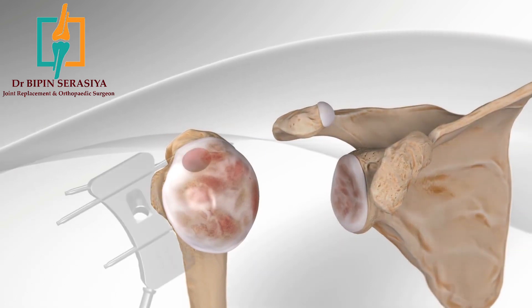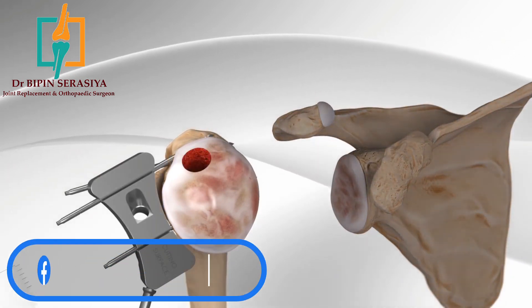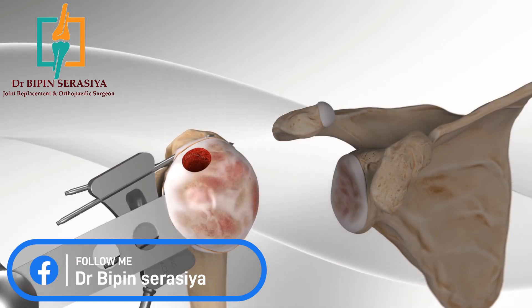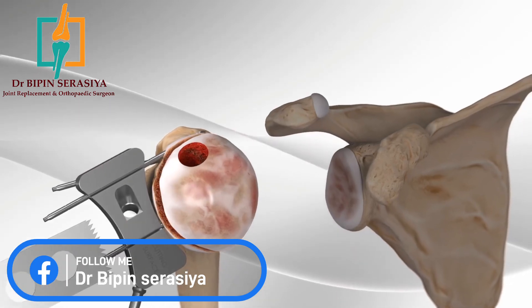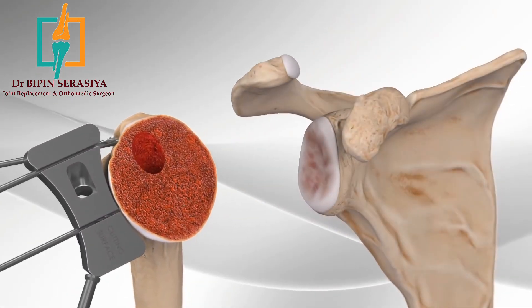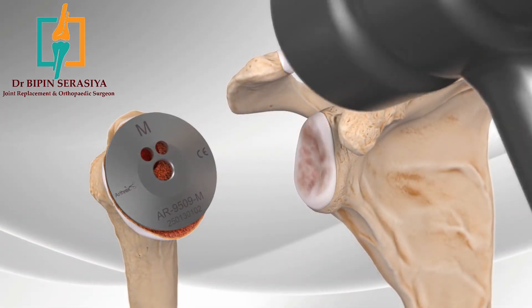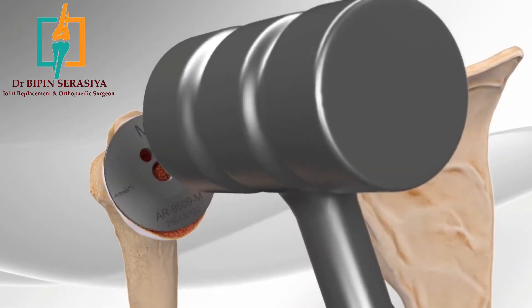The surgeon uses a series of instrumentation to place guides around the shoulder to prepare the humerus. Once the guides are in place, the surgeon removes the damaged area with a saw. A metal plate is placed on the cut surface to determine the appropriately sized implant and to protect the bone during socket preparation.